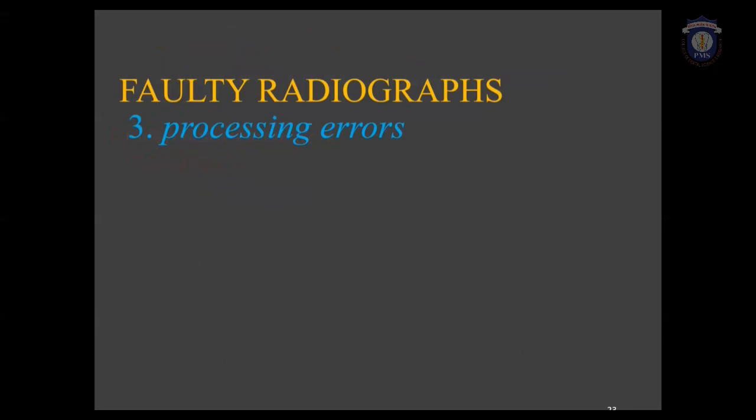That was about exposure errors. So with this, we complete placement, projection errors, exposure errors. Next is errors that occur due to processing.